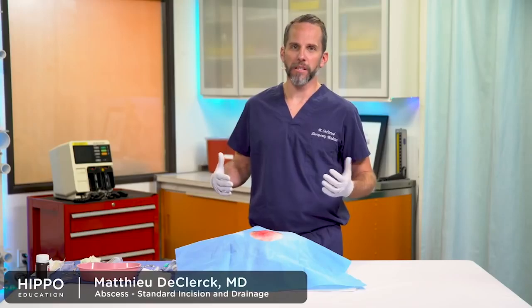In this video, I'm going to teach you how to do a proper I&D of an abscess. When you're talking about an abscess as a focal infection — purulent material in the subcutaneous tissue — the only treatment that really works is incision and drainage: cutting it open, draining that pus, and allowing it to heal. Treating abscesses with antibiotics alone is inappropriate and oftentimes will not do the job, because antibiotics just do not penetrate that pocket of pus. You really need to release it for the healing process.